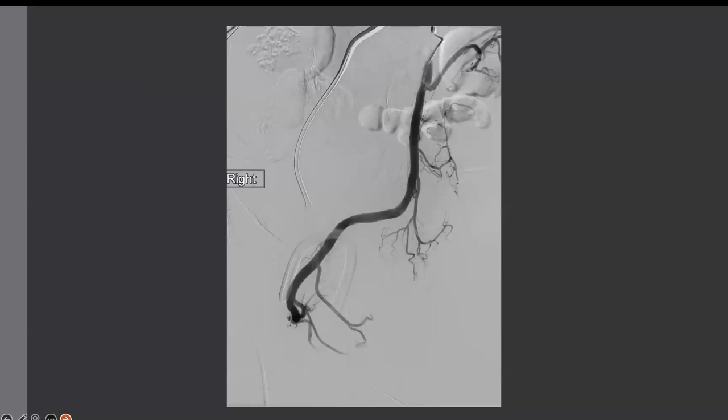Normally the blood flow is from the rectum cranially because the flow should be antegrade through the liver. But in this case, you inject contrast and it goes retrograde down to the rectum. And that tells you that there's significant portal hypertension there. It's reversal of flow. It's called hepatofugal flow.